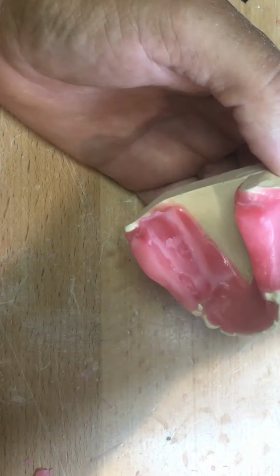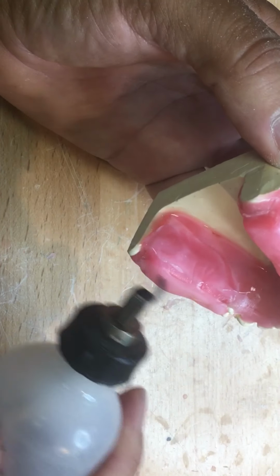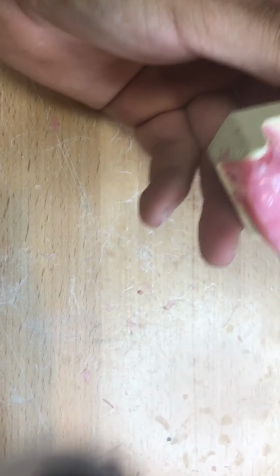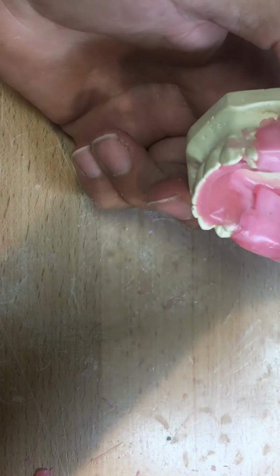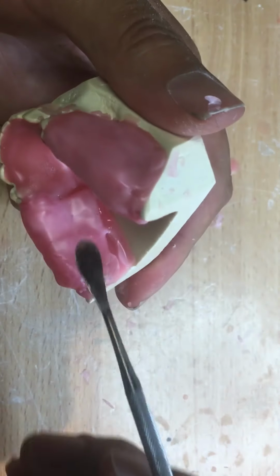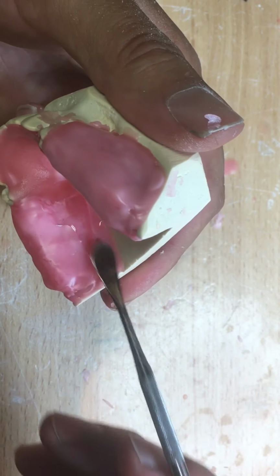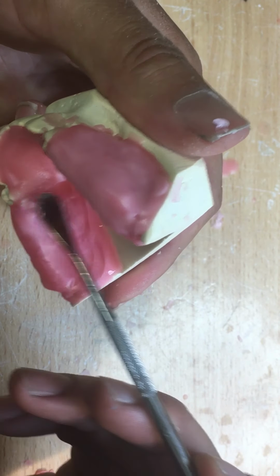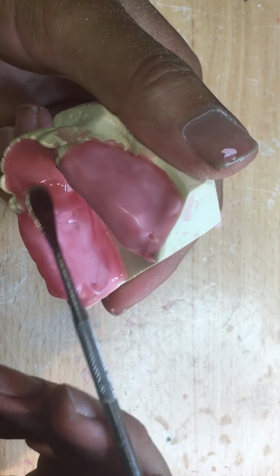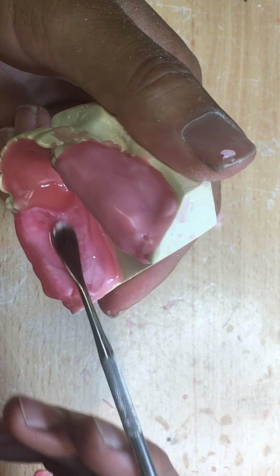You can use your alcohol torch a little bit. Try to create more one piece. Make the wax a little more homogeneous. Especially on the lingual side here, I missed. Sometimes I get busy talking and off subject, enjoying myself. I forget the whole lingual side here. Okay.